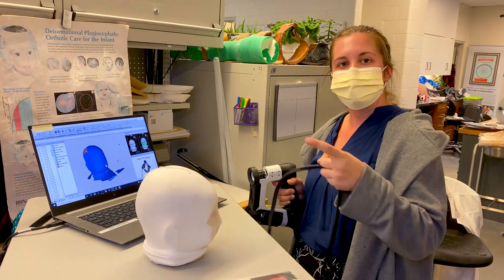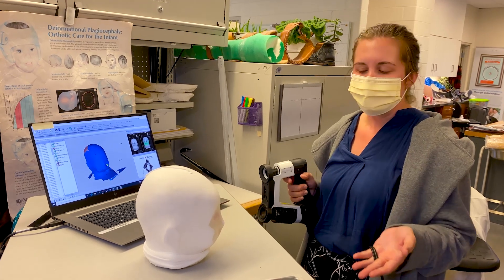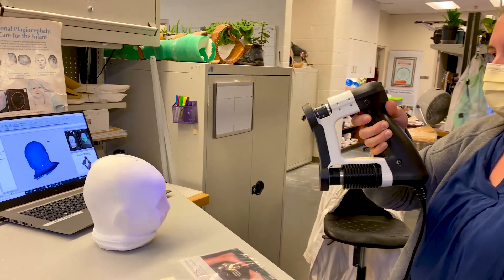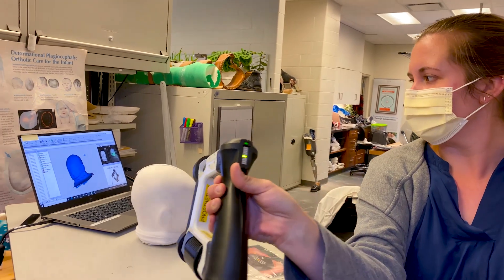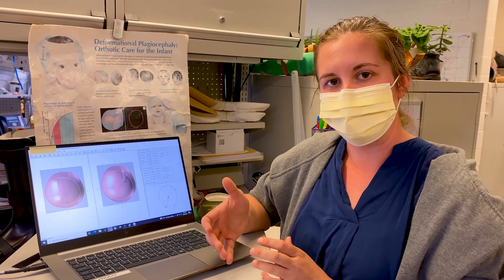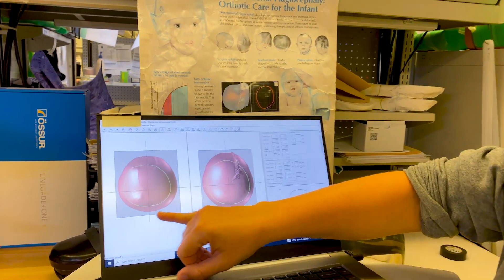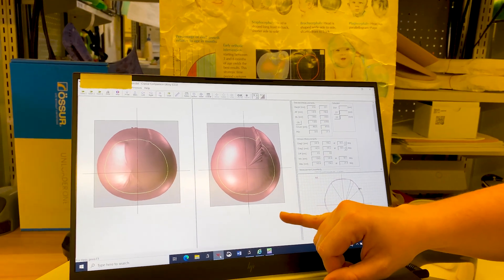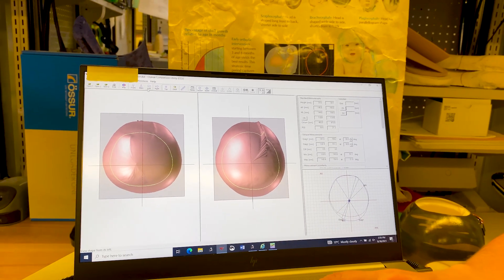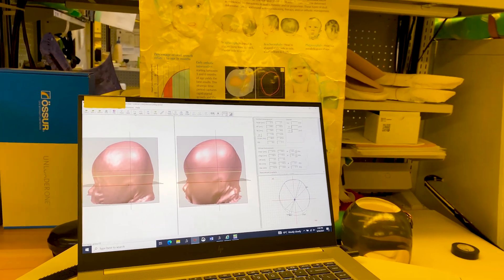One of the steps is to take a scan of the patient to create the 3D model and rectify it into the final helmet shape. We use scanning technology to take many pictures of the patient and it puts it together on screen. We use a start scan to make the helmet, and also to compare to the end result. You can see this head has flattening at the back, and then four or five months later the head is much more oval with more space at the back — and from the side they have much more purchase underneath, so silly party hats no longer fall off.